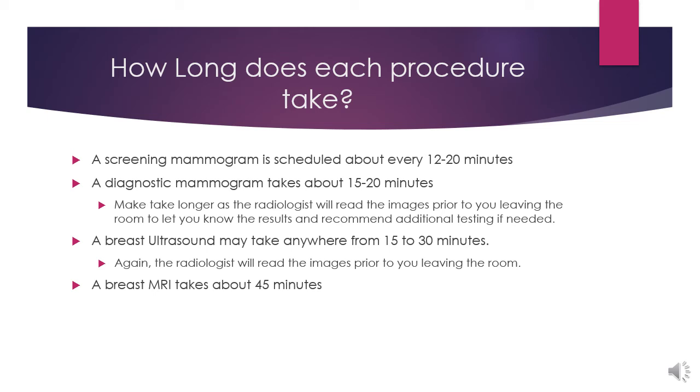Would they go for a continued yearly mammogram? Would they get a mammogram in 6 months? Or should they go for more additional testing in addition to that diagnostic mammogram or ultrasound? The ultrasound takes about anywhere between 15 and 30 minutes. Again, if it's in conjunction with that diagnostic mammogram, that patient will stay until the radiologist reads the exam. The MRI takes about 45 minutes.